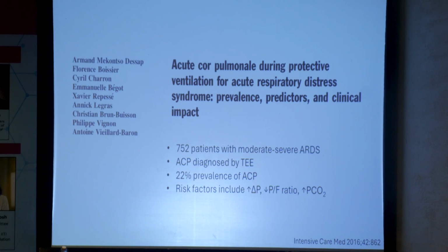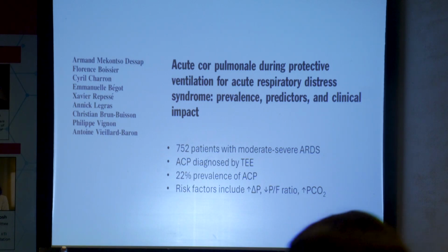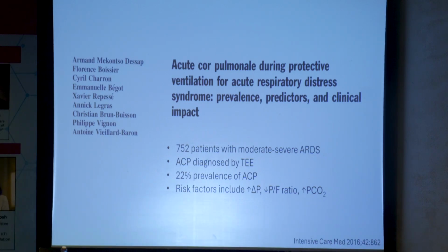Yeah. Extracorporeal CO2 removal is a technology which has been studied, but is not routinely used in North America, and I don't know if it is in other places. Italians use it a lot. Yeah, so that's basically CO2 dialysis, where you have a much smaller catheter and much lower flows. It's not ECMO.